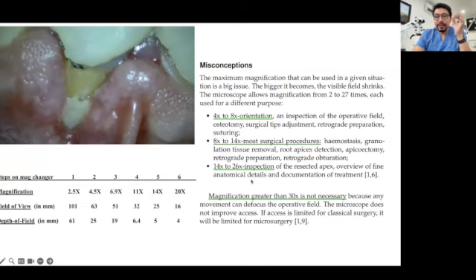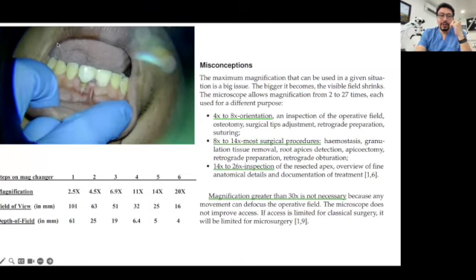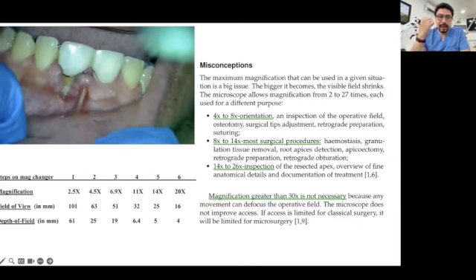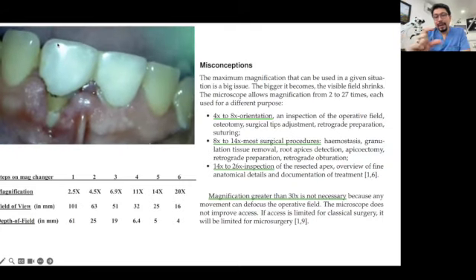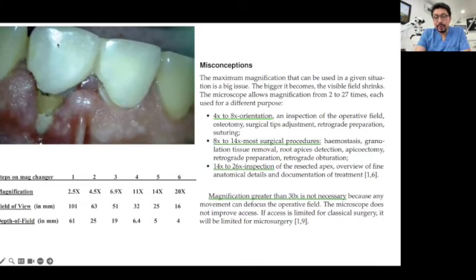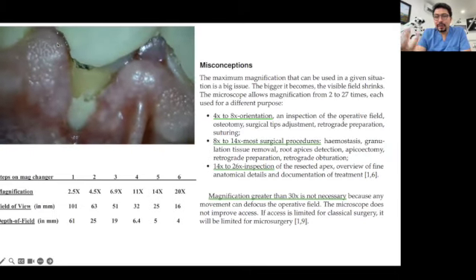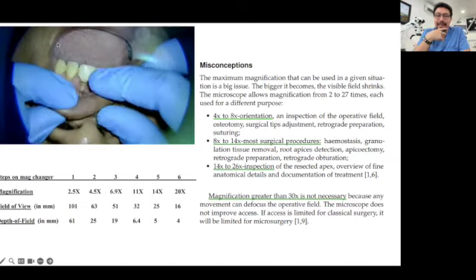That's why it's a big mistake trying to work in the higher magnifications. You are going to be frustrated if you want to do your procedures at the 6th step, in 20x or 24x. Your patient will move a bit and you will be out of focus. If you work in the 5th step of magnification, maybe the molar will be in focus or the anterior teeth will be in focus, but if you try to use the mirror, you are not going to have a good focusing in the area. Or if you are going to use the bur, you are going to have a good focusing on the bur or on the tooth, not both at the same time.